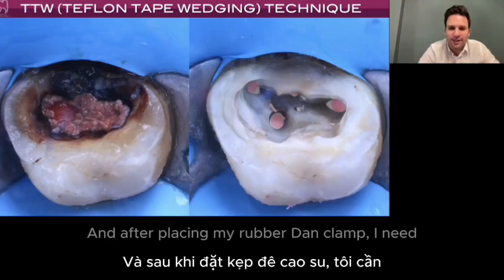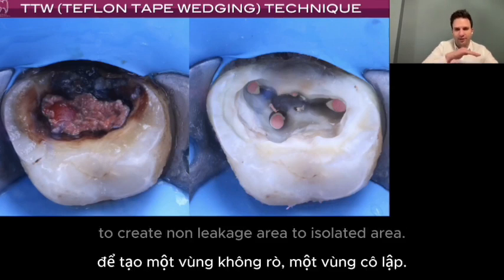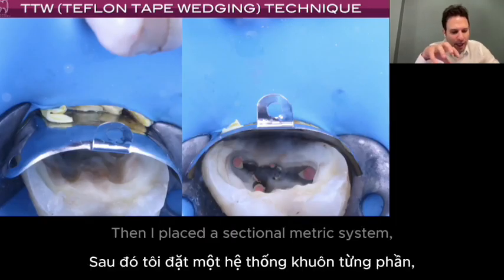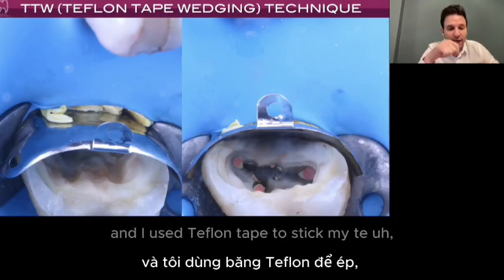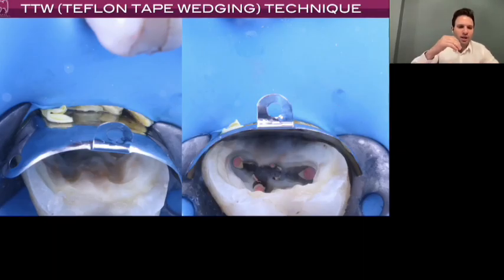After placing my rubber dam clamp, I needed to find a solution to create a non-leakage, isolated area. Then I placed a sectional matrix system, and I used Teflon tape to stick my sectional band to the proximal side of the tooth.